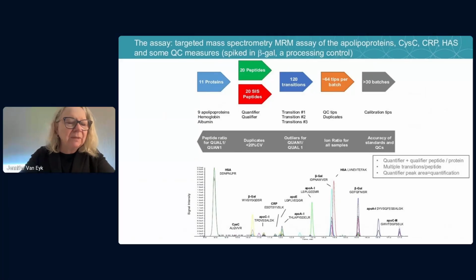If we're doing dried blood spots, it's done very similarly. There's just a first step that we have to do off the little tissue piece or filter paper piece. And again, this is just a way to really have high quality data all the time by controlling it.